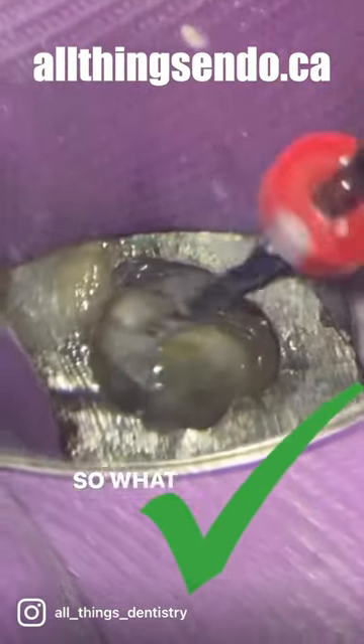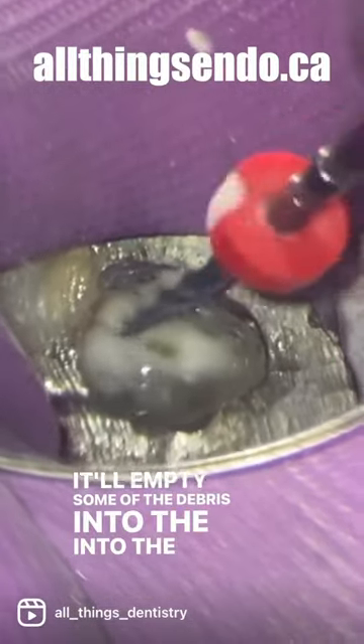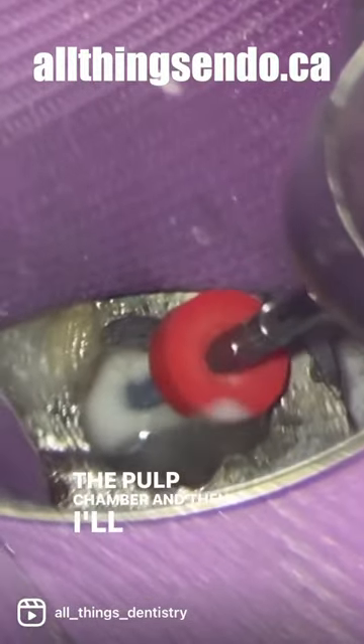Now I'm going down to MB2. I'll go down, bring the file back out — it'll empty some of the debris into the irrigant in the pulp chamber — and then I'll take the file back down.